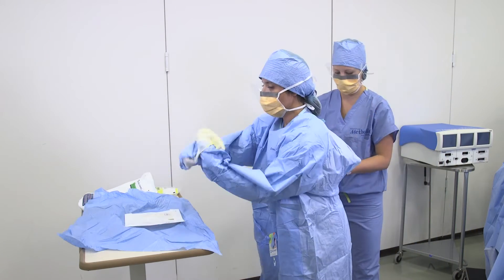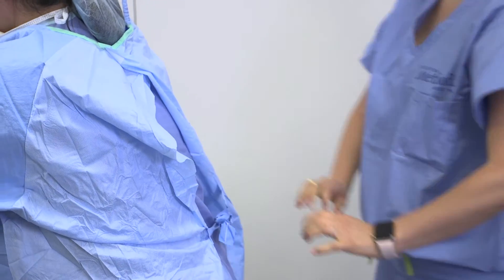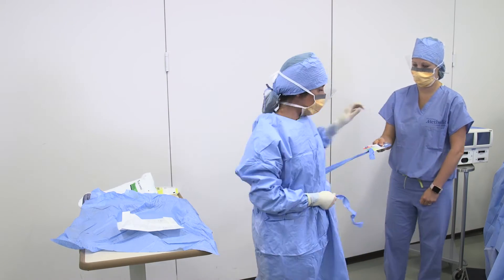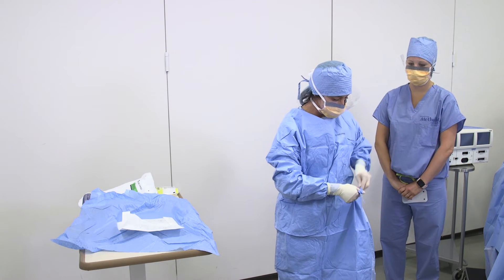They will then put on the sterile gloves. The non-sterile team member will tie the back of the gown. Grab the tag on the front of the gown and hand it to the non-sterile team member. Spin around while they hold the tag. Once the tag is removed, you can tie the gown.